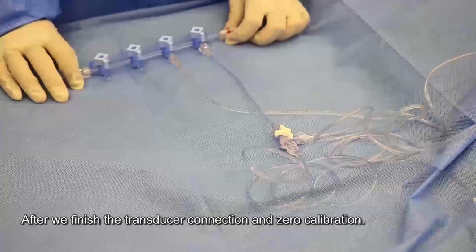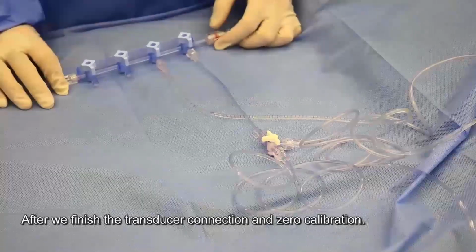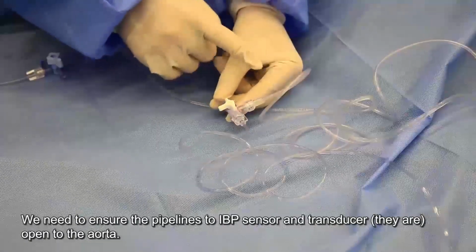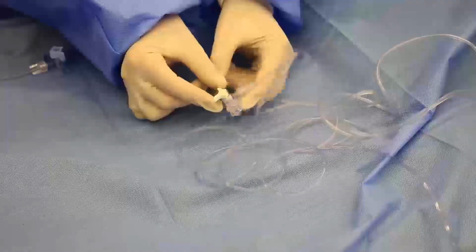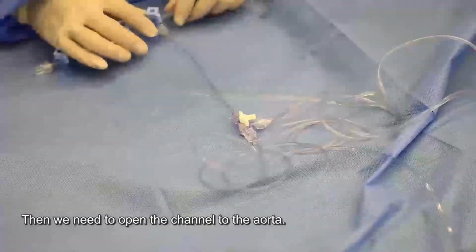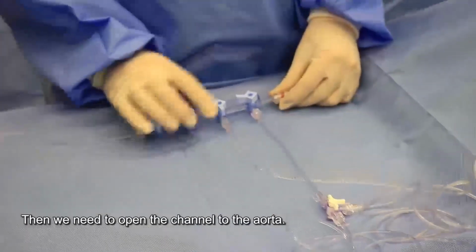Okay, now, after we finish the transducer connection and zero calibration, we need to make the channel to the IBP sensor and to the transducer open to the aorta. Just rotate the valve like this. And then we need to open the channel to the aorta. This open.